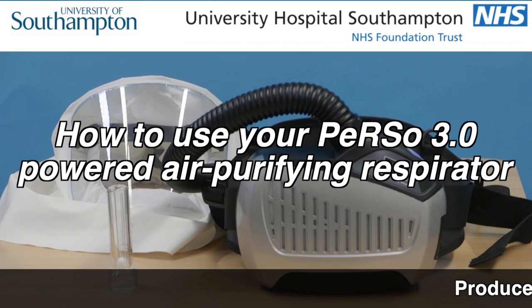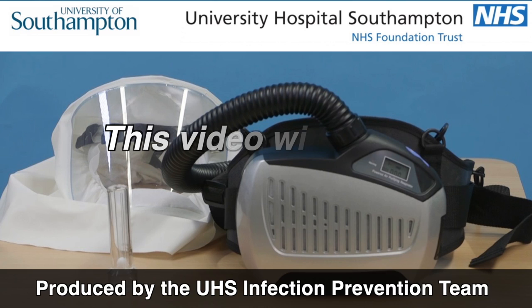This video will show you how to use your Perso 3 respirator. It includes preparation for use, donning, doffing and decontamination.